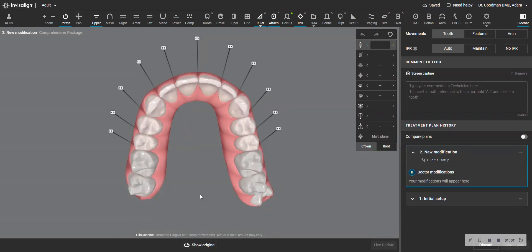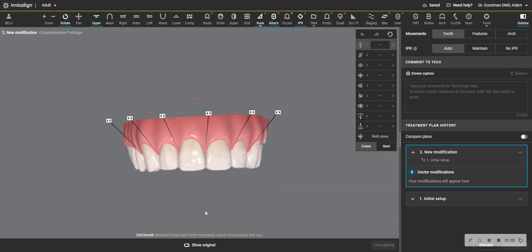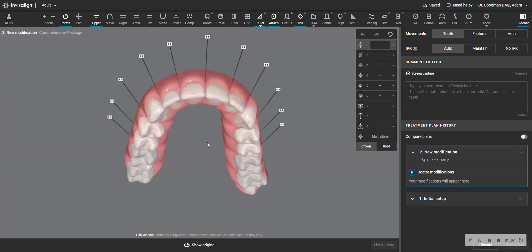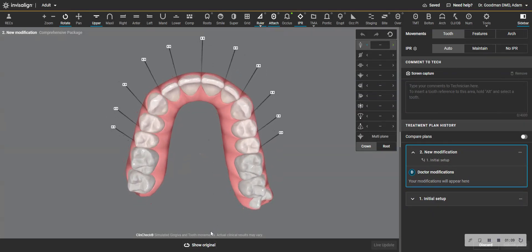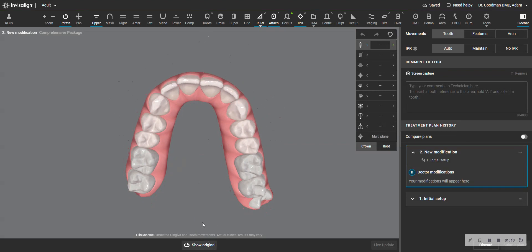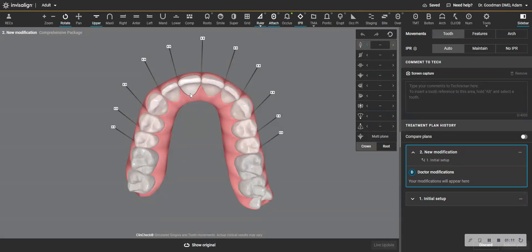And also the central, it is rotating in. But notice there's really no angulation change. We're just rotating the distal in. And so I don't want to see as much palatal root torque as there is.